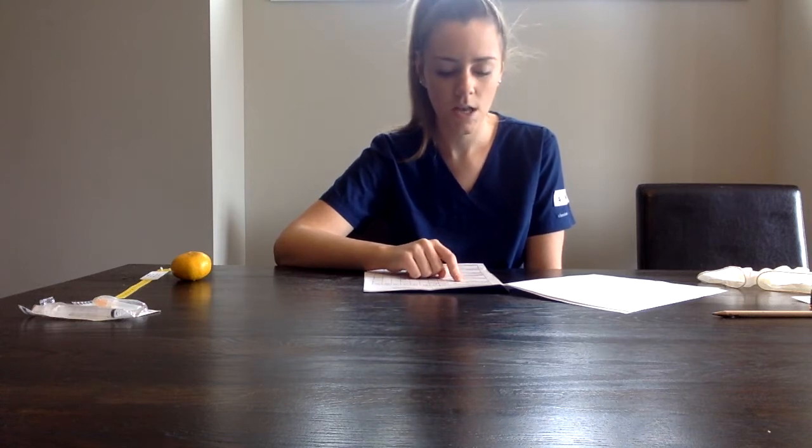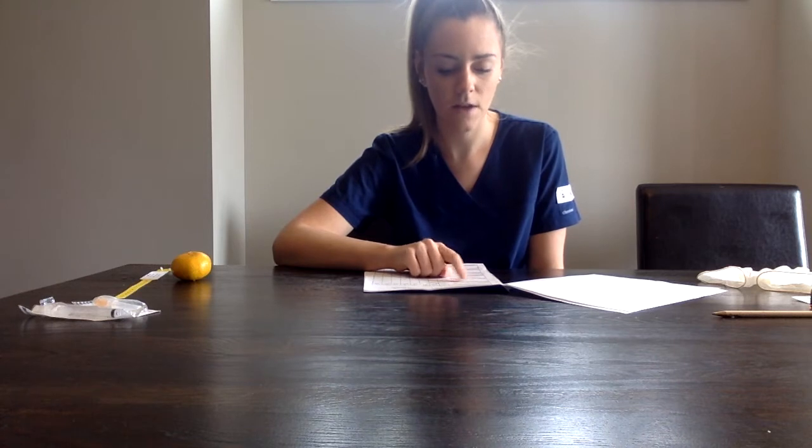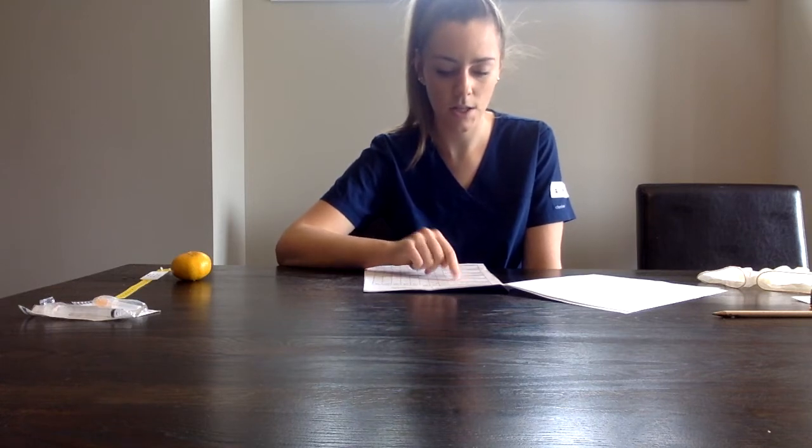by a transcriber and a nurse because we don't have our doctor's orders, so that way we know that part of the first med check has been completed by verifying those signatures. So I see that we can continue with this med because it's been signed by the transcriber and nurse. We're giving hydromorphone, 2 milligrams, subcut.